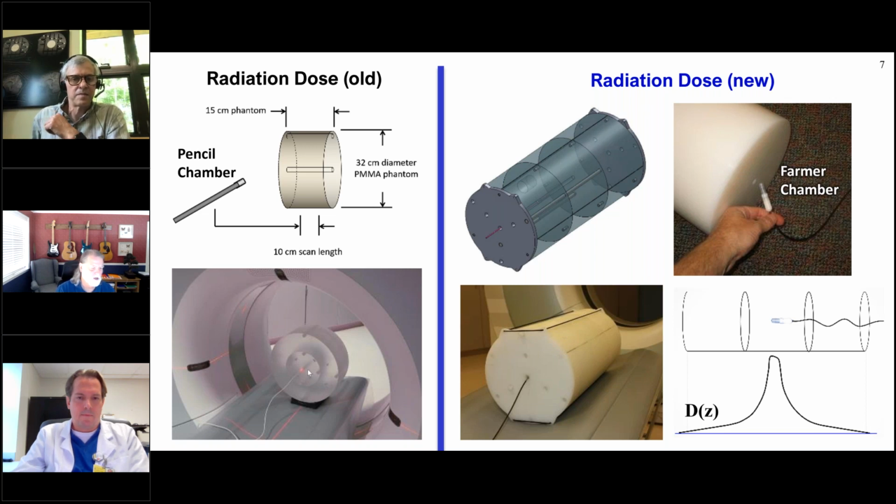It doesn't measure image quality, and we'll talk about that in the next slide, but I've been very active with new dosimetry metrics, as you see in the right panel, and that phantom design picture is from my lab. And I, some years ago, was trying to push a standard related to a more accurate phantom.